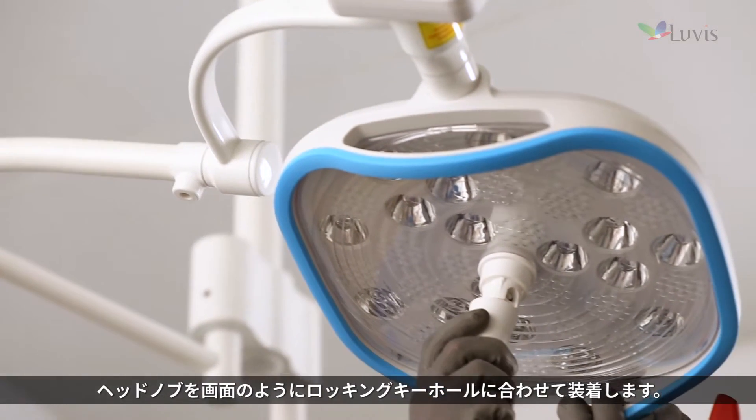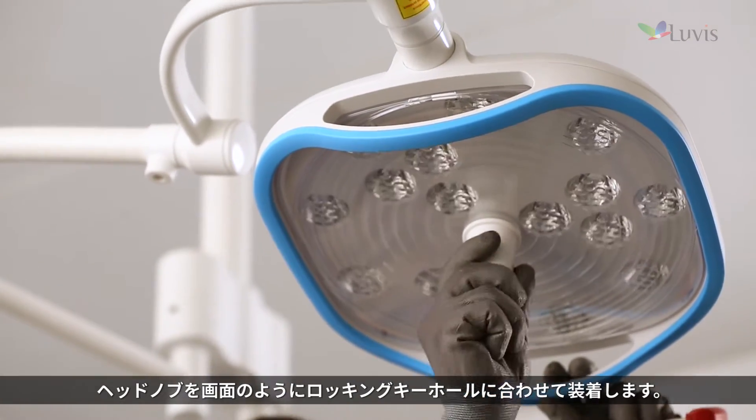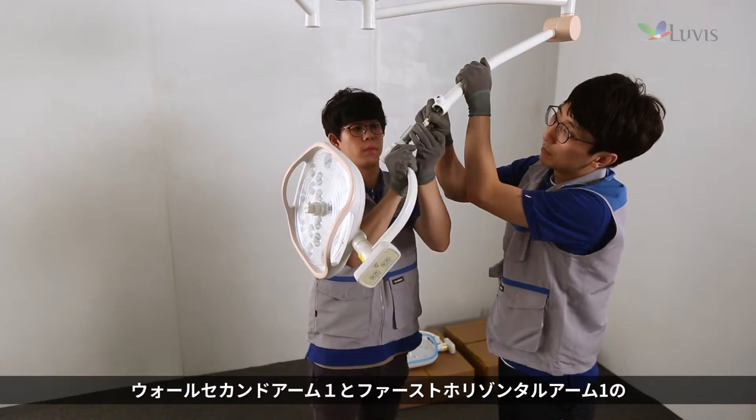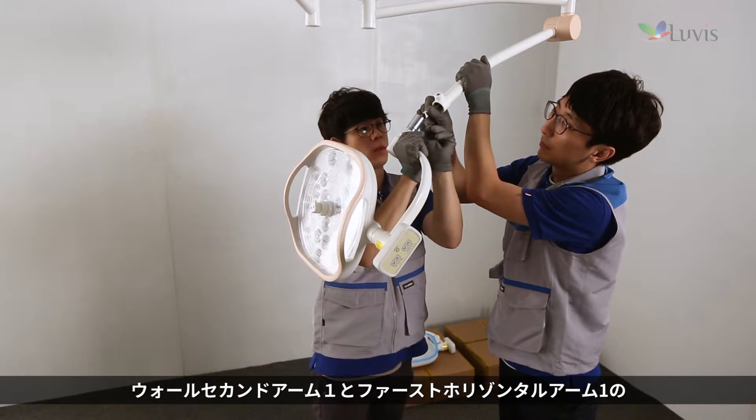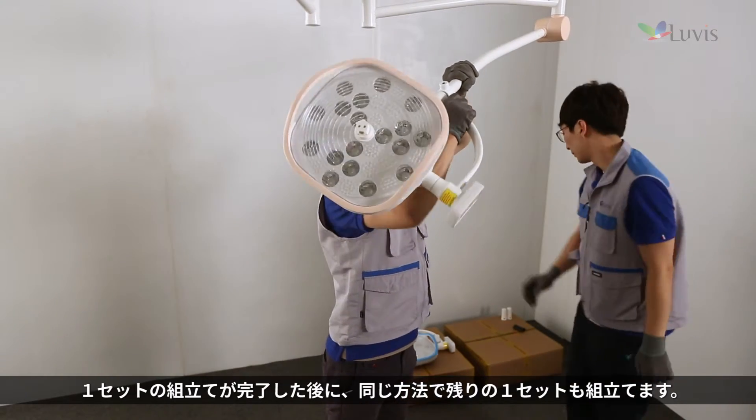Adjust the head knob and install it in the locking key hole as seen on the screen. Once one set of wall second arm 1 and first horizontal arm 1 is completed, assemble the remaining set using the same method.